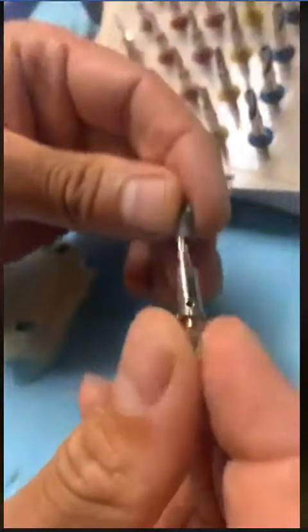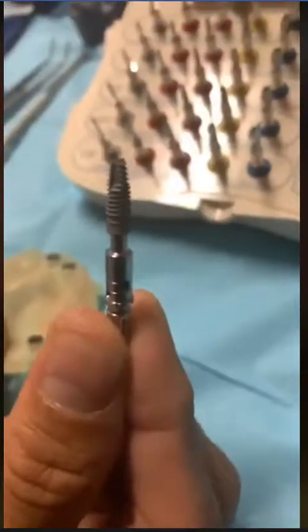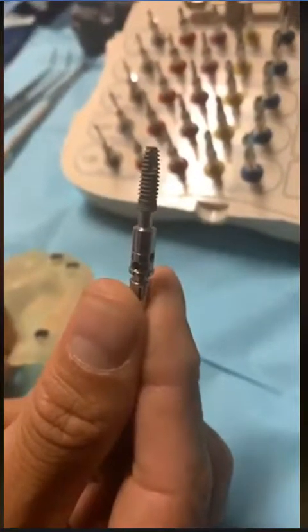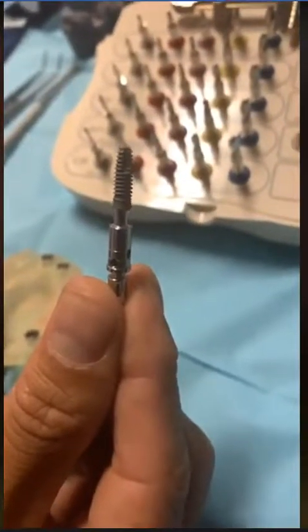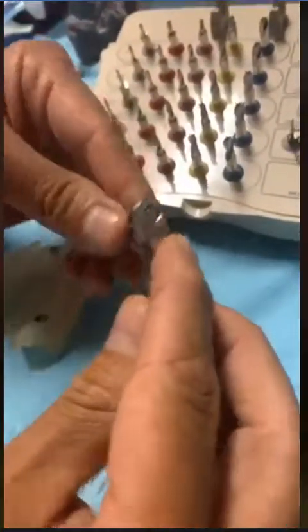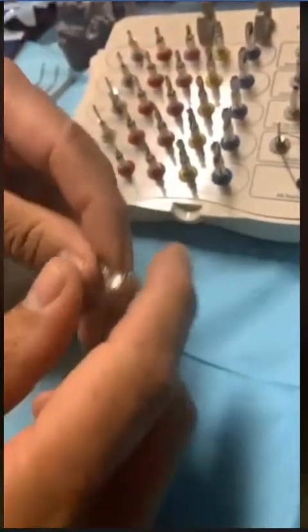These are the dummy implants that people use in my course to actually place an implant. That's what we're going to do. Then you have a carrying tool that you can hand tighten, and we're going to demonstrate that today. You could hand tighten this into the jawbone, and after you hand tighten it, you have a torque driver that connects to the top of this, and you could torque it down.